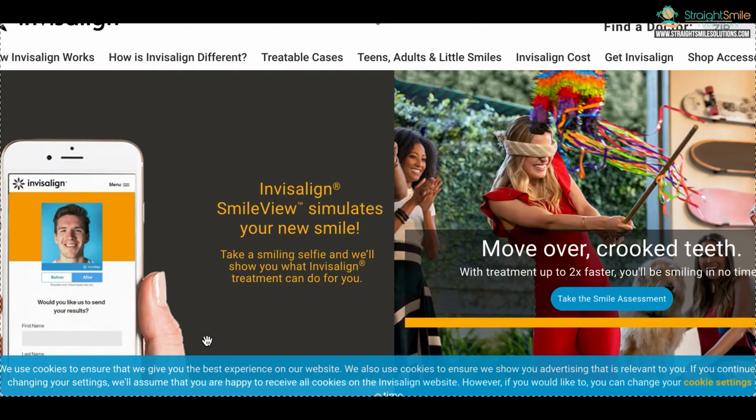And I think personally, I still like GP Ortho Tracking way better, because you could put GP Ortho Tracking right on your website, and you can use it not only for virtual check-ins, but also virtual consults. Two different things, right? And we know Invisalign does have a virtual consult option as well, but again, you know, it's a lot of steps to get in.